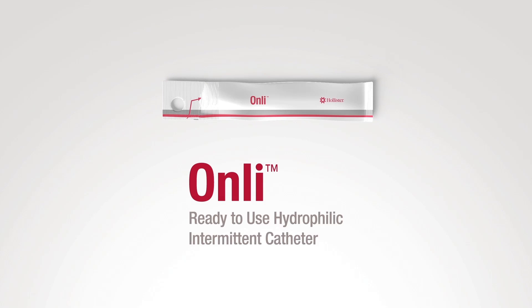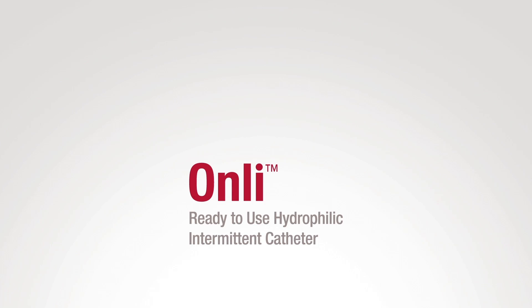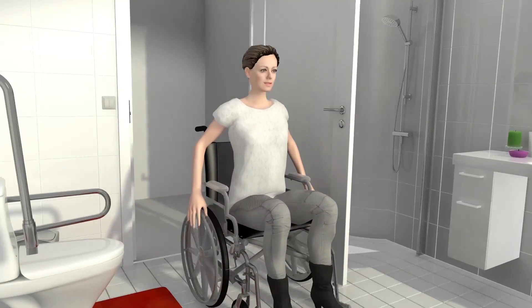Only. The ready-to-use hydrophilic intermittent catheter works with you on a daily basis. The pure water vapor hydration technology provides smooth insertion and makes the catheter ready for use right out of the package.